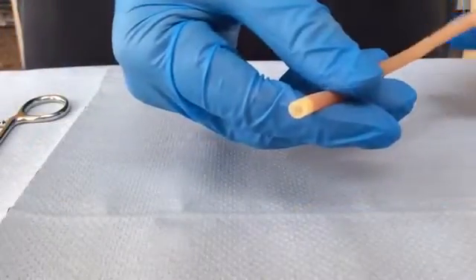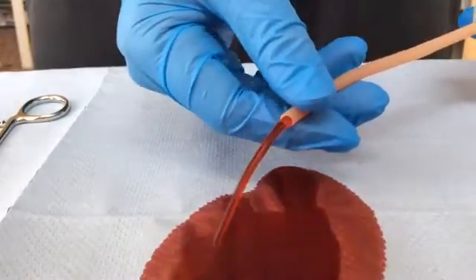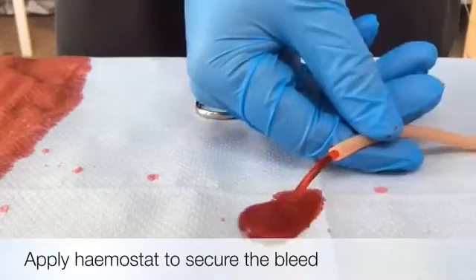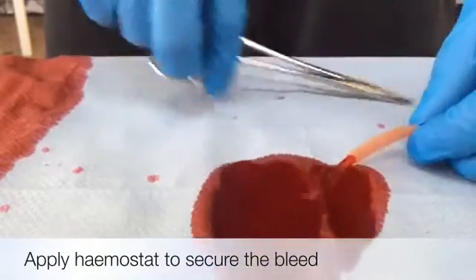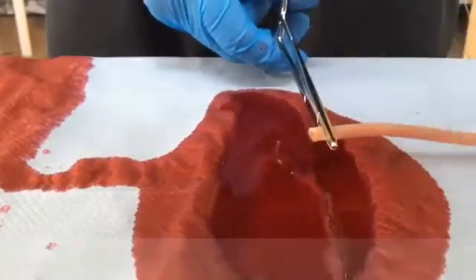This is to demonstrate a bleeding blood vessel. When you are presented with a bleeding blood vessel, you have to apply pressure to it. This can be either with your fingers, or with a haemostat if present — clamp it off like so.